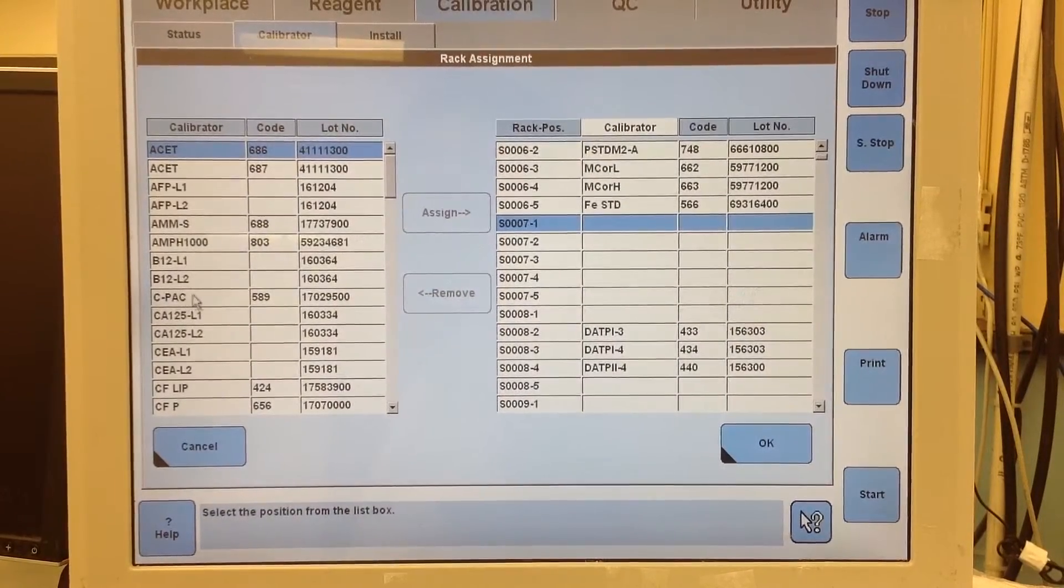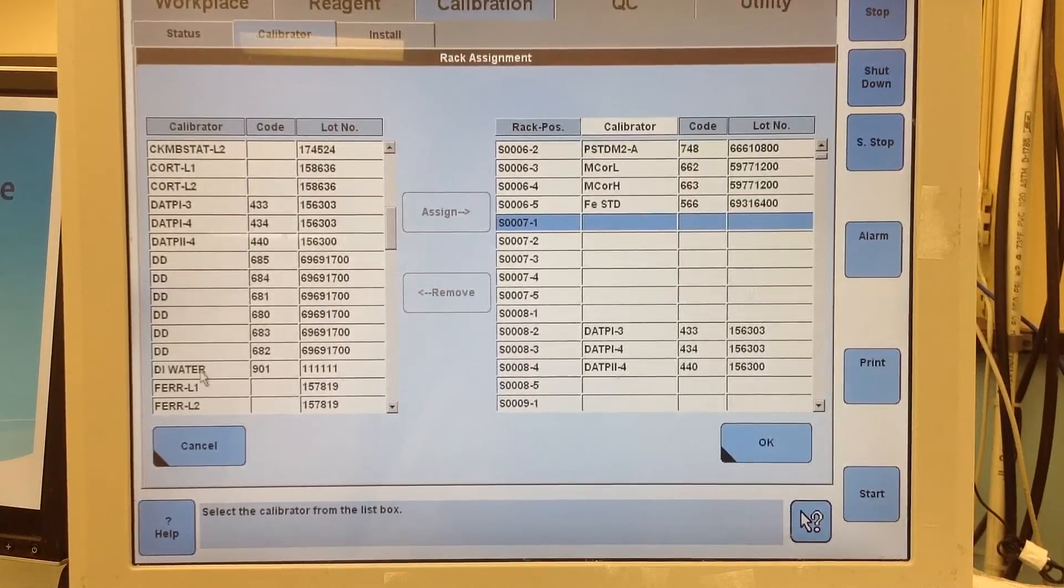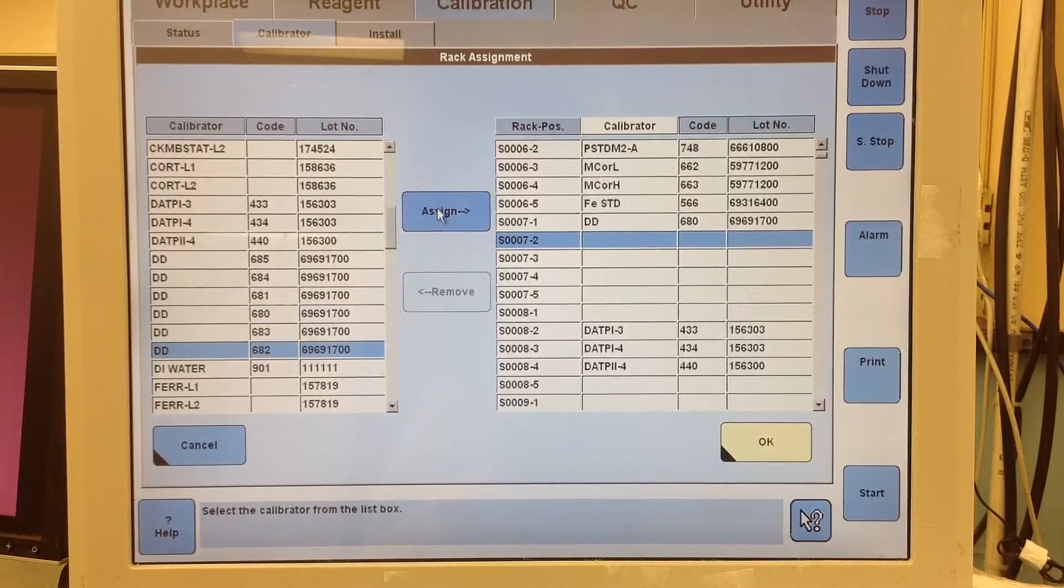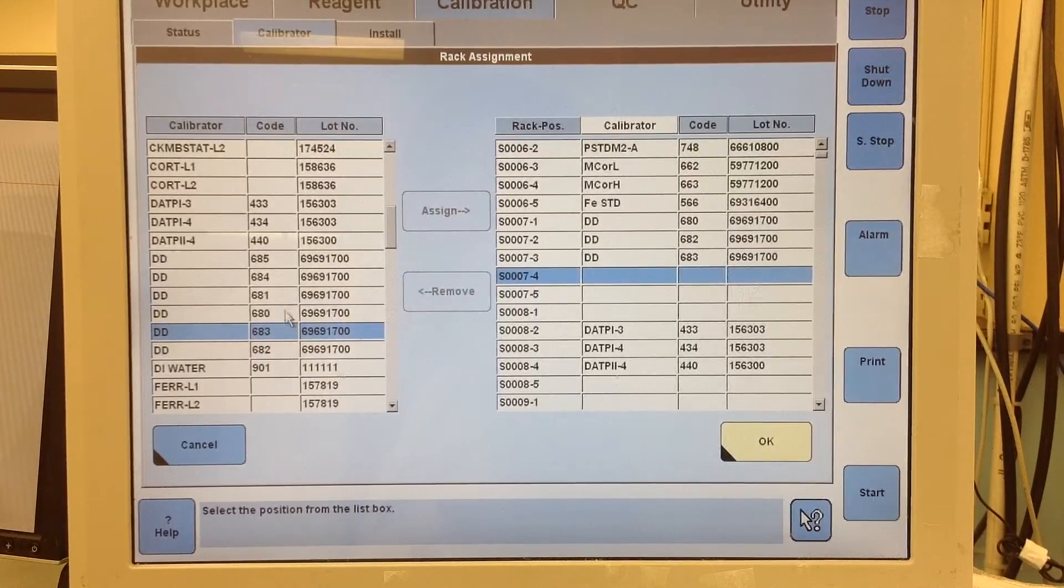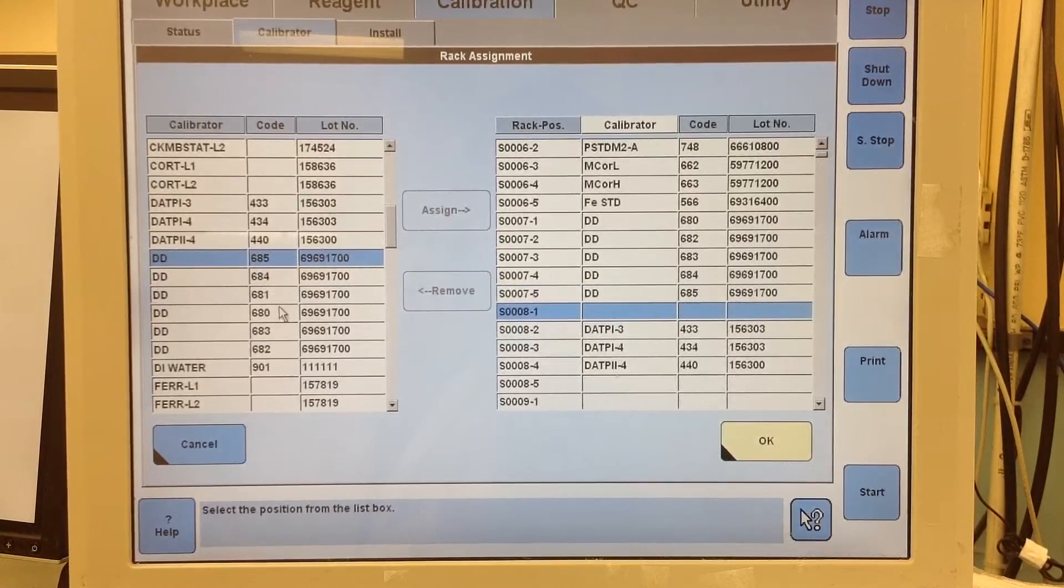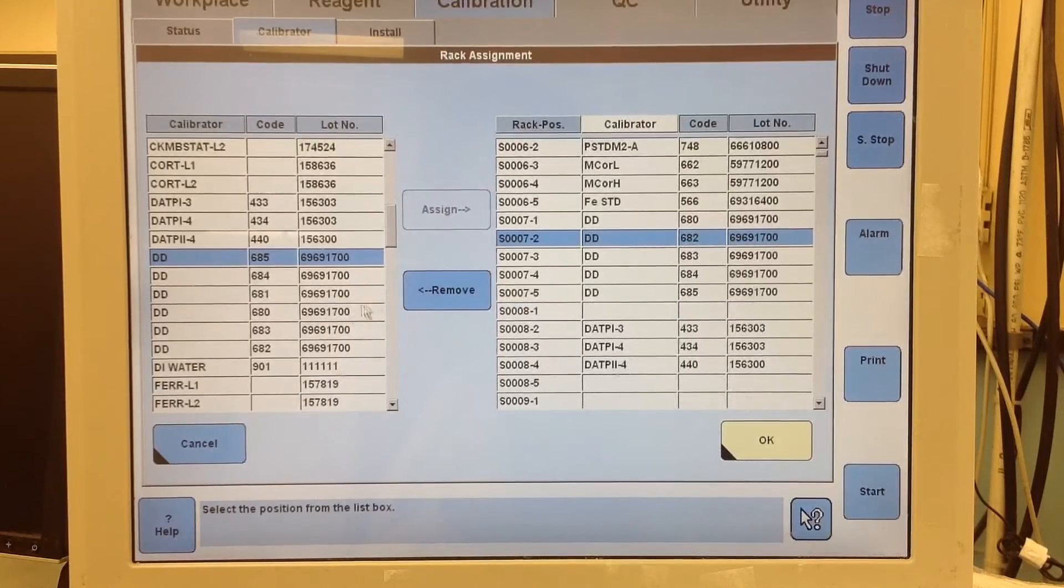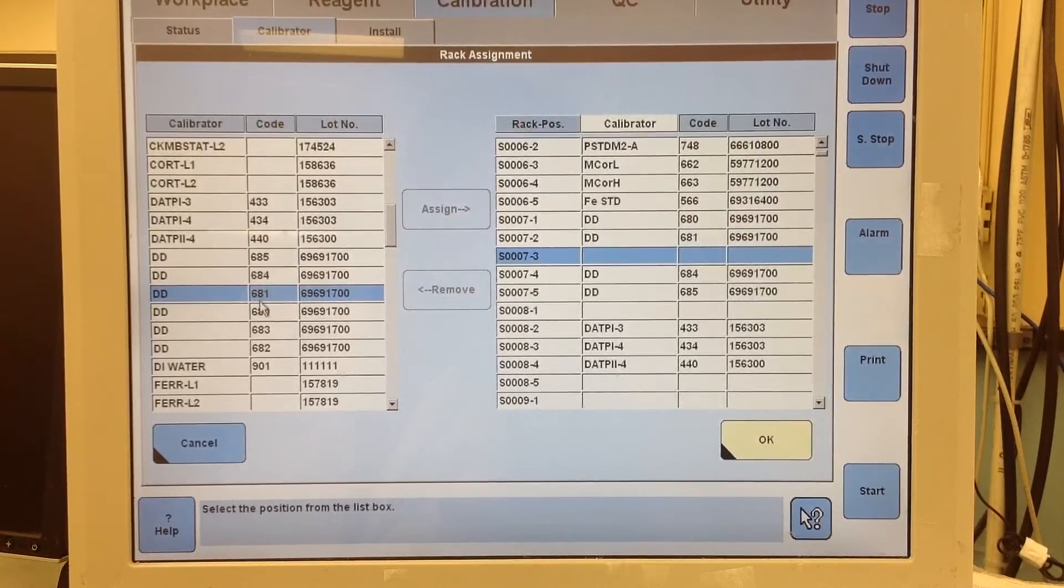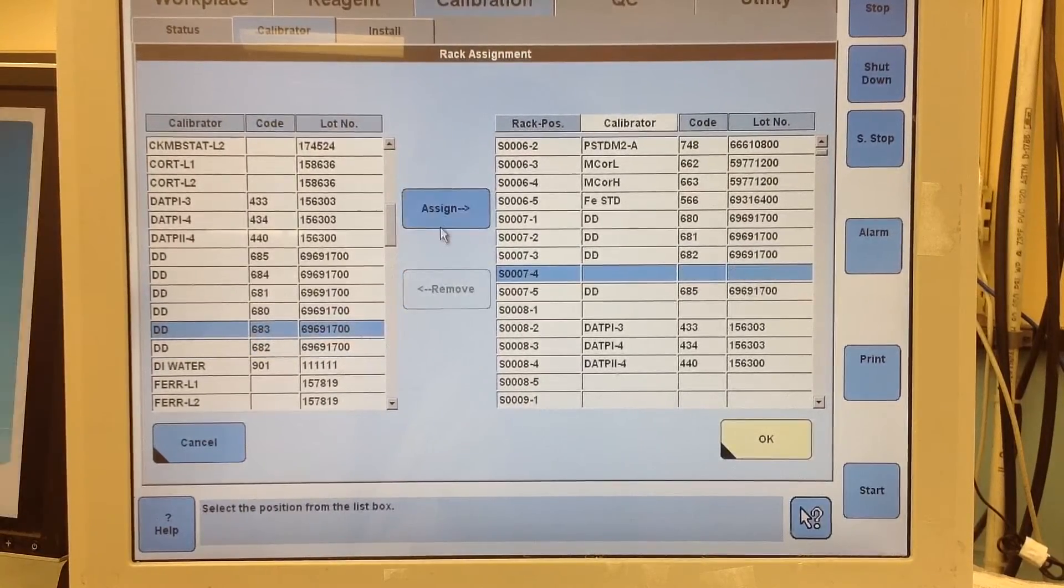And then just go ahead and make sure you put the right calibrator in the right spot. See they're all kind of scrambled up here, but 680 was number one. Let me just do that in numerical order. I messed up. I missed 681. So now I've got to remove and assign them in the right order. It's important to make sure this is right or your calibration is definitely going to fail.